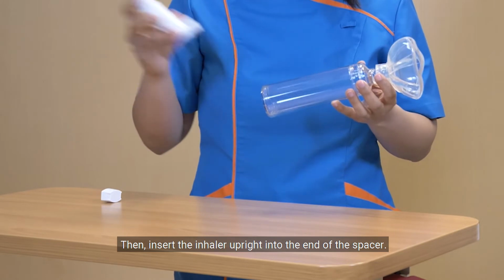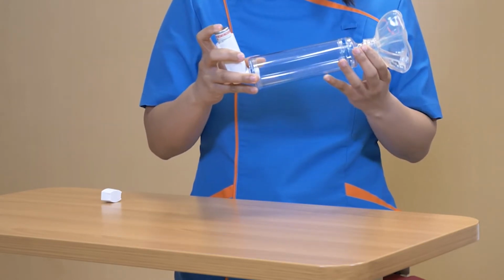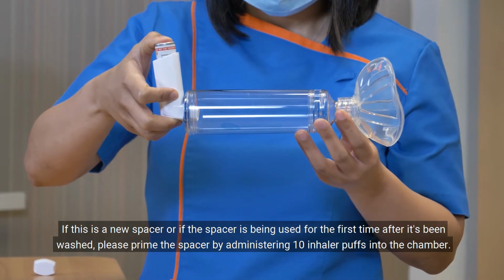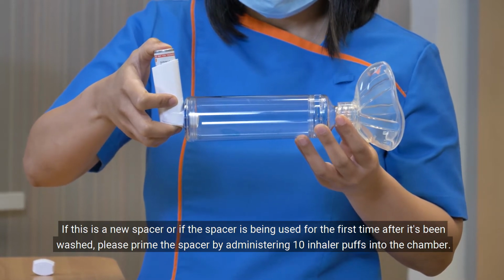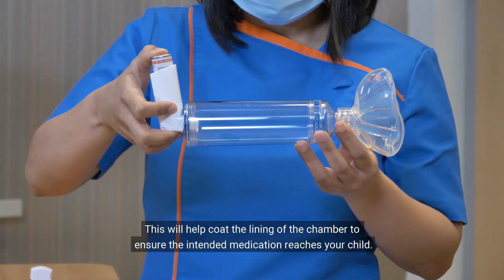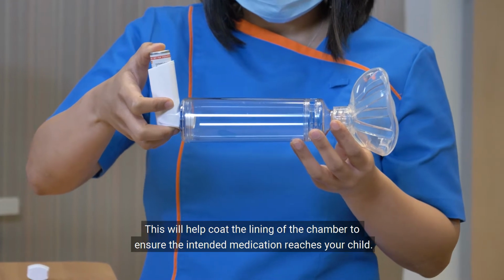Then, insert the inhaler upright into the end of the spacer. If this is a new spacer, or if the spacer is being used for the first time after it's been washed, please prime the spacer by administering 10 inhaler puffs into the chamber. This will help coat the lining of the chamber to ensure that the intended medication reaches your child.